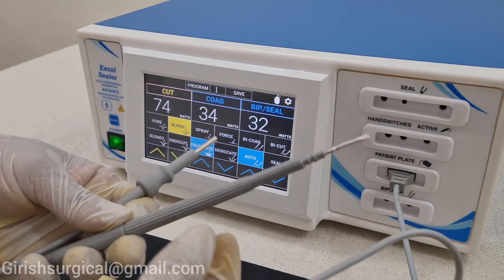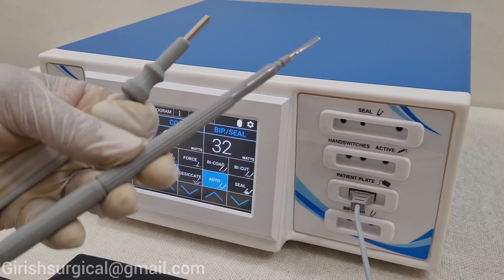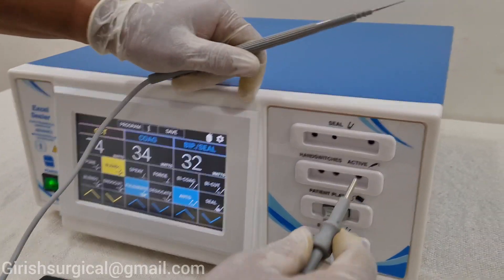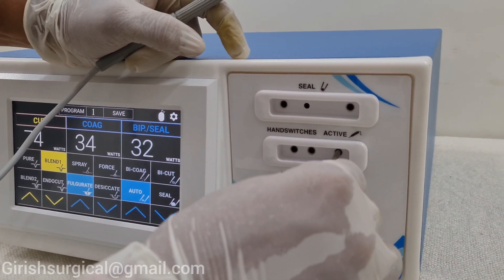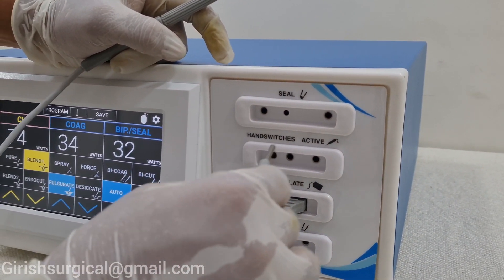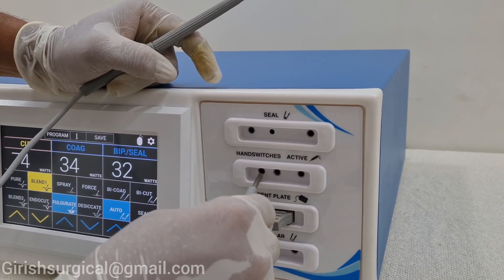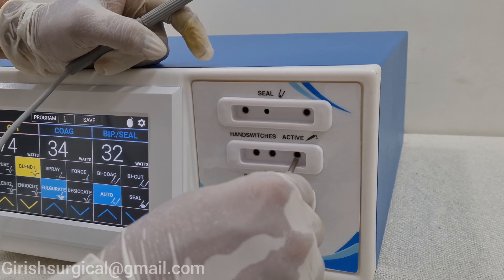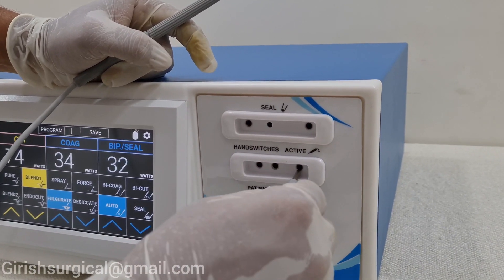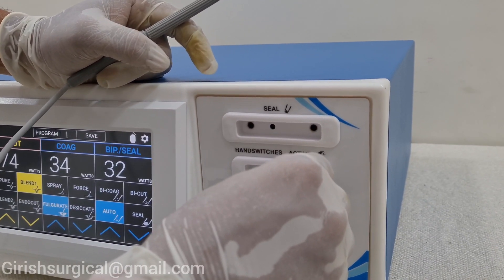With the machine you will be getting an active handle which is reusable and autoclavable. This is the handle and this is the banana jack pin which will go to the active port. In this we will be using the hand switch as well as the foot control. Two holes are there — which are a little closer — and one more which is a little far. This jack pin will be going to the port which is a little far from the two jack pin holes.